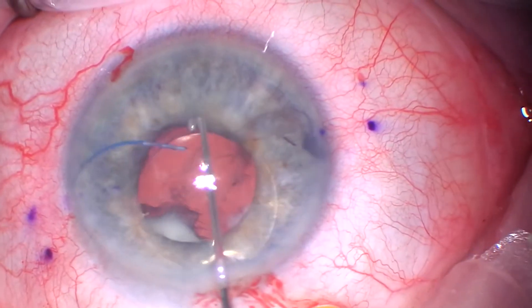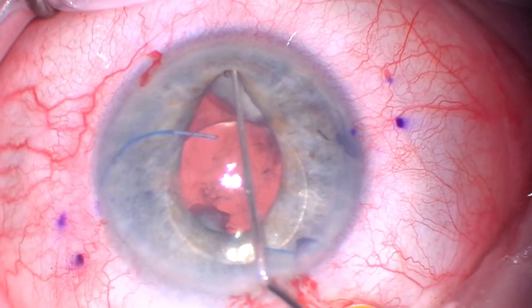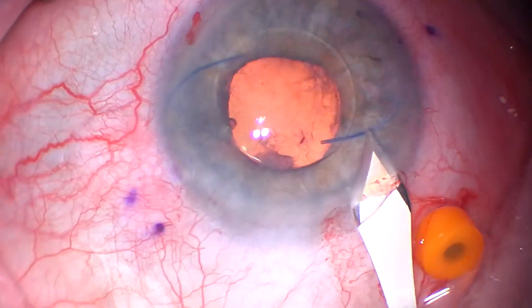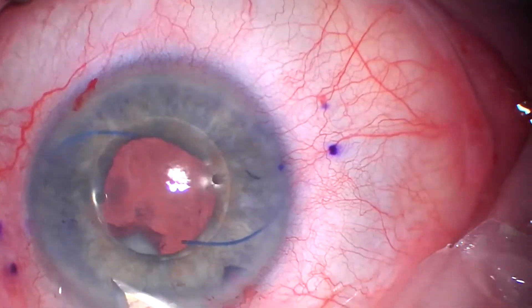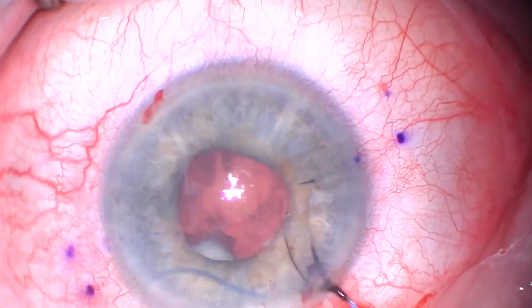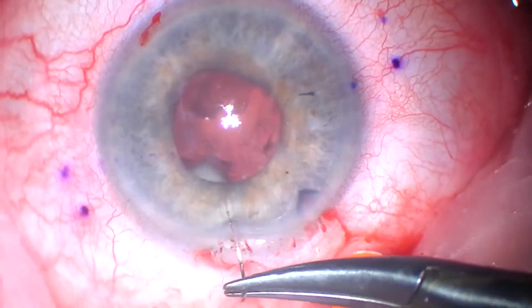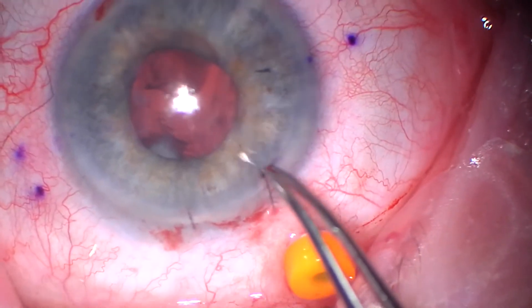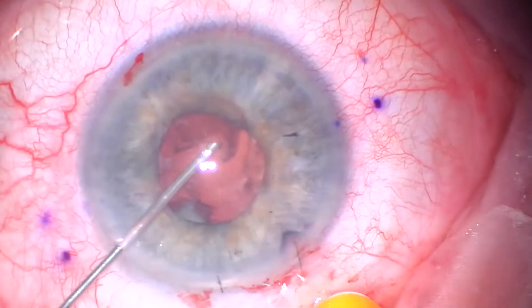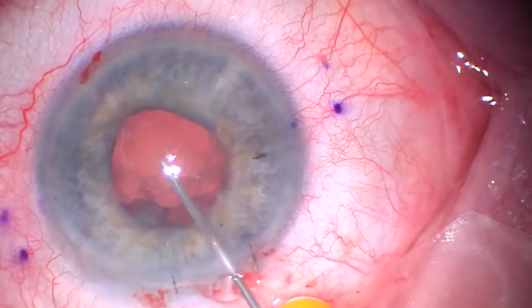So what I'm going to do is inspect. I'm thinking, could I put it back in the sulcus and just position it better? But the Soemmerring's material is so huge that I just know there's not really going to be a good way. So I expand the wound and decided to take it out. I edited that part a little bit — I'm sure nobody cares to watch me place sutures in the cornea. A little extra Viscote.